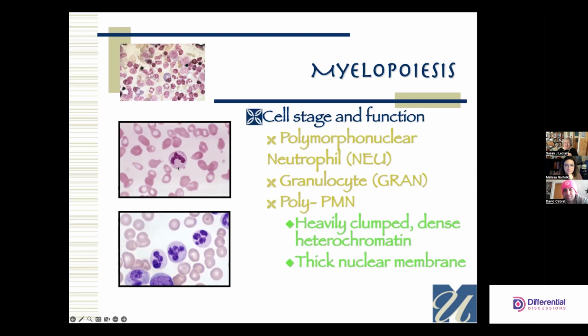They were alive until I caused them to dry up. What are they trying to tell me? This one's trying to tell me it likes platelets. Who doesn't? Well, and if you like platelets, how much do you like platelets? Is it just kind of a friendly meeting, or do you go to this bar a lot? How do you handle that?